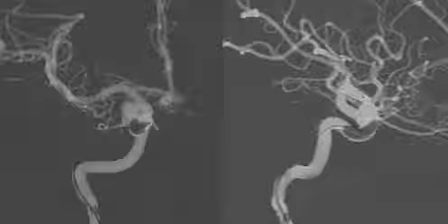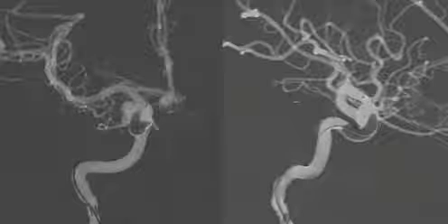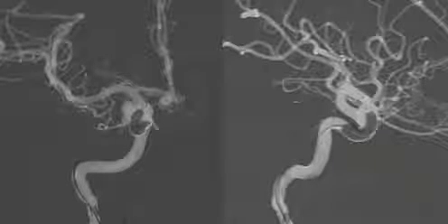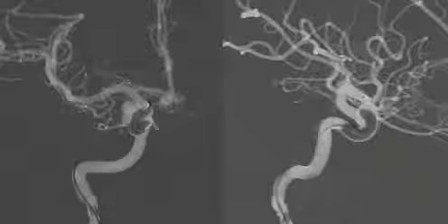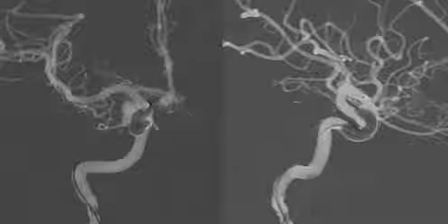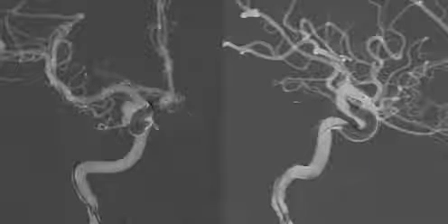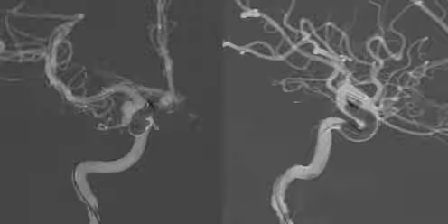At the moment we're seeing a balloon that has been placed past the aneurysm, and when the balloon is inflated it fills the normal blood vessel and the aneurysm is beside the balloon. It allows us to place a second catheter into that aneurysm and place the coils into the aneurysm while the balloon is inflated to protect the parent vessel and avoid having any coils come out of the aneurysm and into the normal artery.